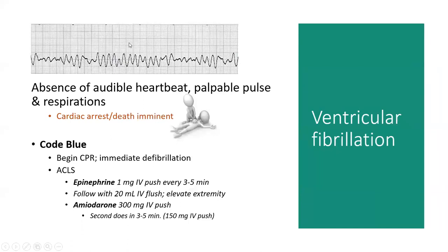If I see this rhythm, I'm immediately going to that patient's room and checking on the patient. And if the patient doesn't have a pulse, then I'm calling a code blue. I want to begin CPR, immediately defib. ACLS: epinephrine, 1 milligram IV push every 3 to 5 minutes.